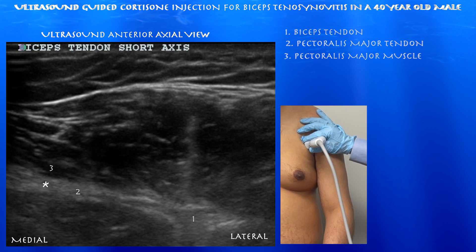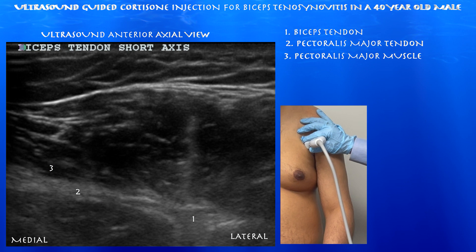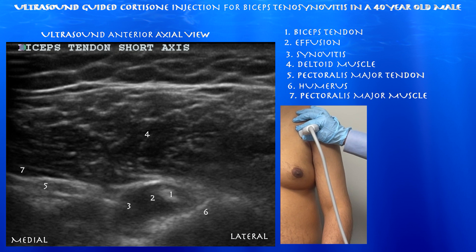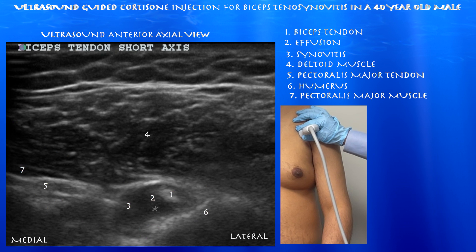Here's a good view of the pec major tendon. You can see how it basically goes over the biceps tendon and acts like a sleeve, stabilizing it over the anterior aspect of the humeral shaft. Here again, you can get a good view of the pec major tendon, with a fair amount of synovitis and fluid around the biceps tendon.